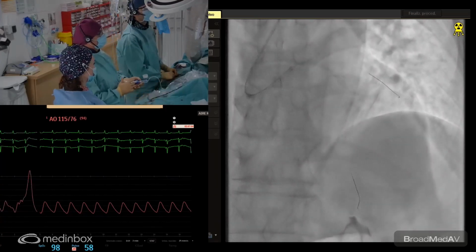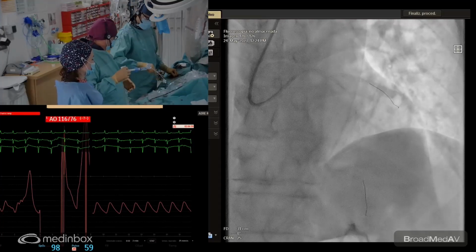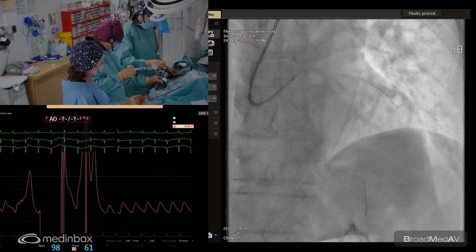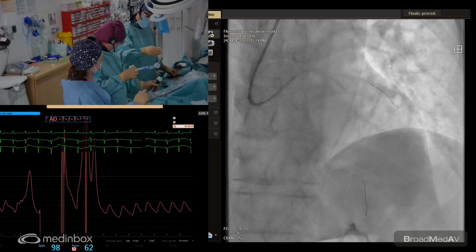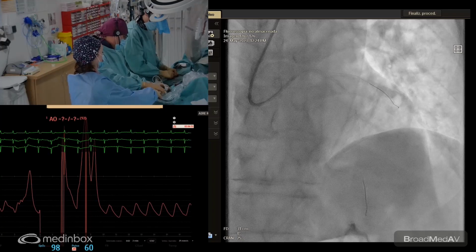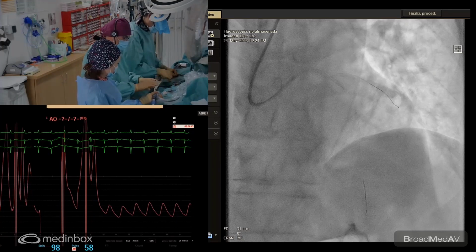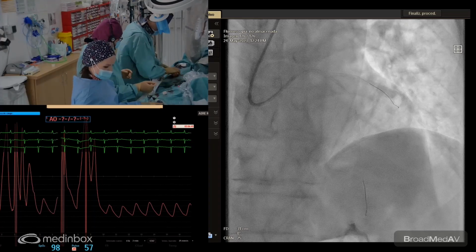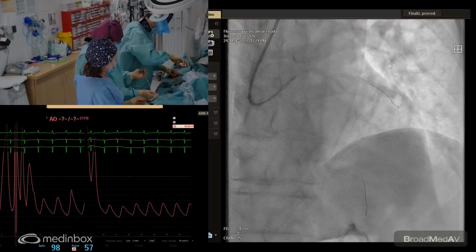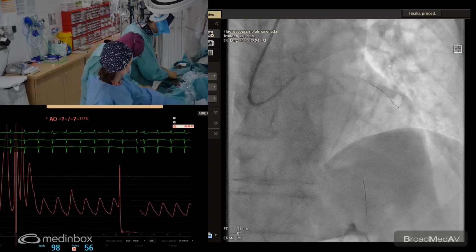Retrieve the balloon. Okay. Let's check with a test. Test, please. Yeah. The flow is conserved. The diagonal is there. So be careful. This is the thing. If you retrieve it, you can kink the balloon. Okay, I'm retrieving the shockwave balloon.